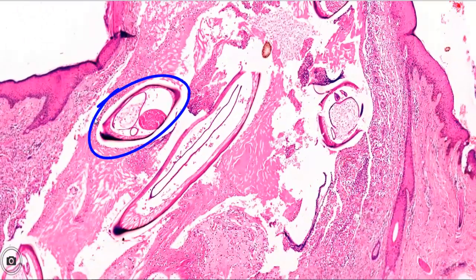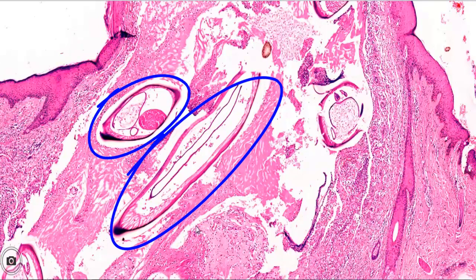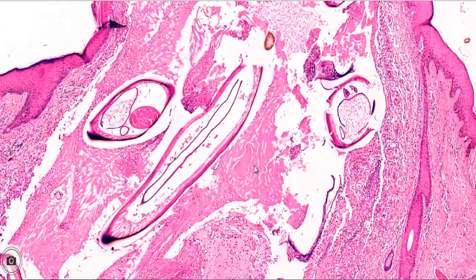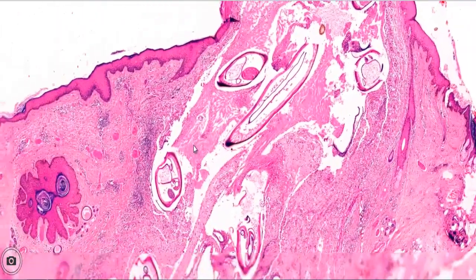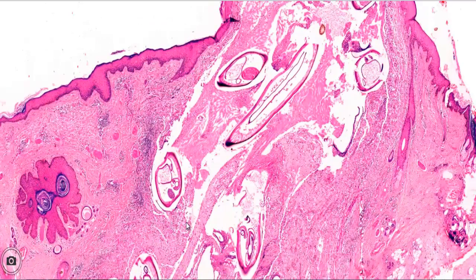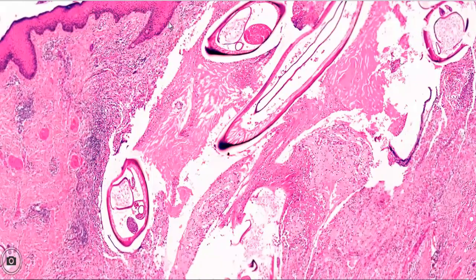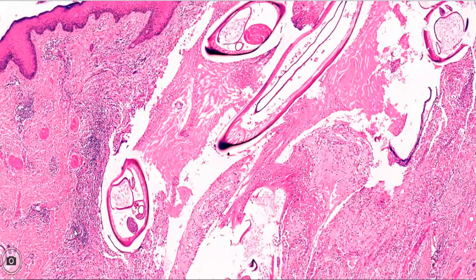Here we see inflammatory cells with fibrinous exudate occupying the cystic cavity, along with another worm cross section. In effect, we have a tangled mass of many worms lying in this cystic space under the epidermis in the subcutaneous tissue, surrounded by inflammatory infiltrate.